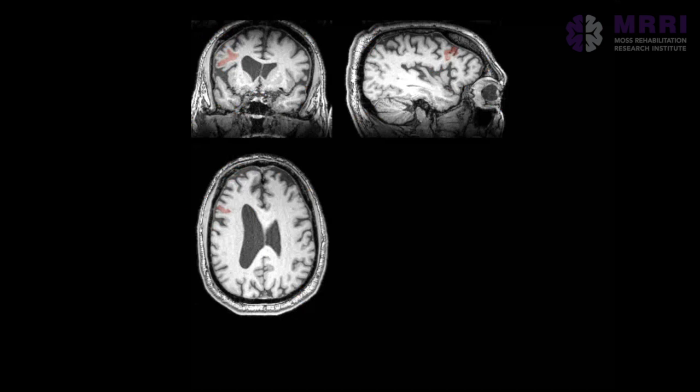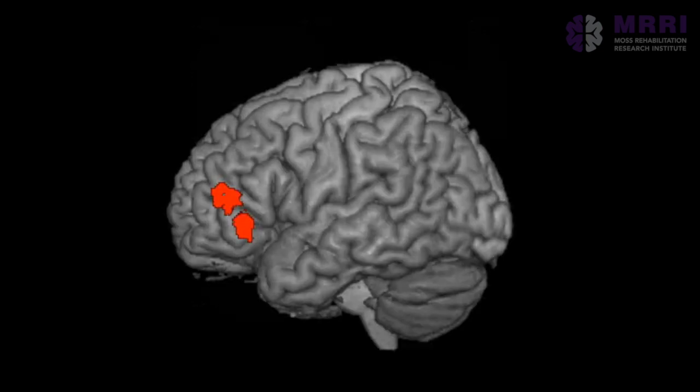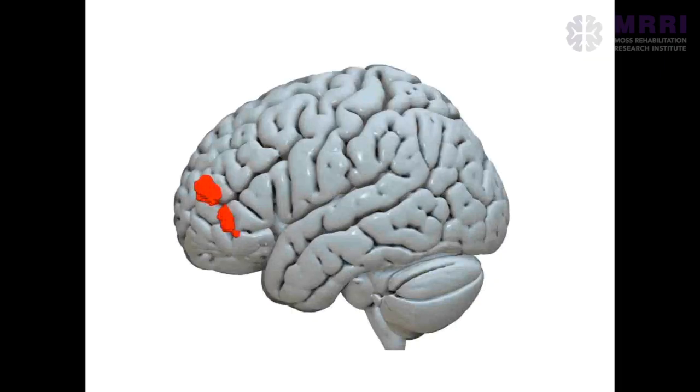Okay, and so the point with this approach especially is that it is built to study lesions that are, as Aaron said, big lesions have large disruptive effects. Patients tend to be overall impaired across the board. But actually small lesions can have large disruptive effects if they're in close proximity to major white matter tracts. So take, for instance, this patient with a small left inferior frontal gyrus lesion, okay? So this is typically the output that we get after having warped this to MNI space, okay?